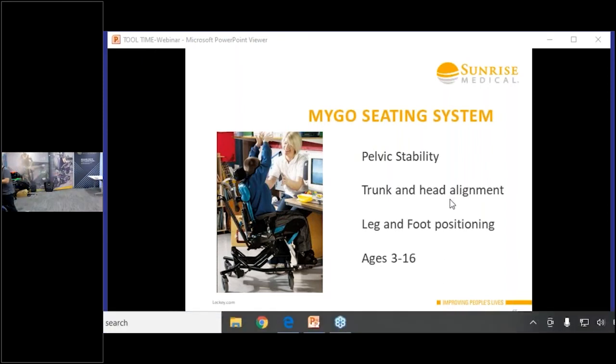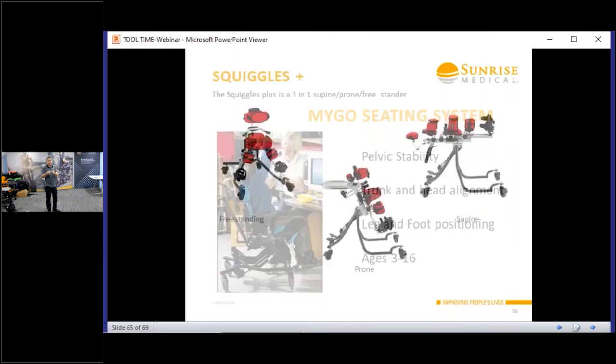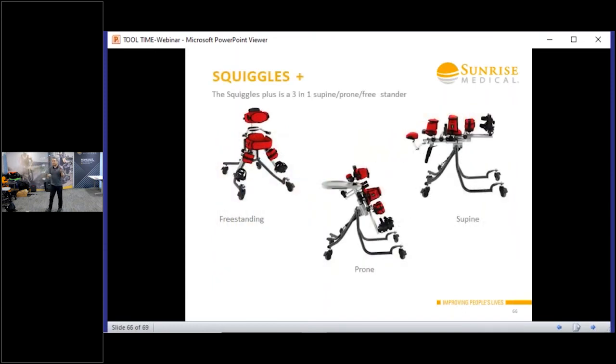So this is all with that Leckey T-bar. So we're talking tools, we're talking the toolkit. On this toolkit, you get 2, 2.5, 3, 4, 5, and 6 mil, and a screwdriver end, a Phillips and a flat. That's all we're working off for all these adjustments we're doing. It's a really simple yet effective set of adjustments and really easy to go to.